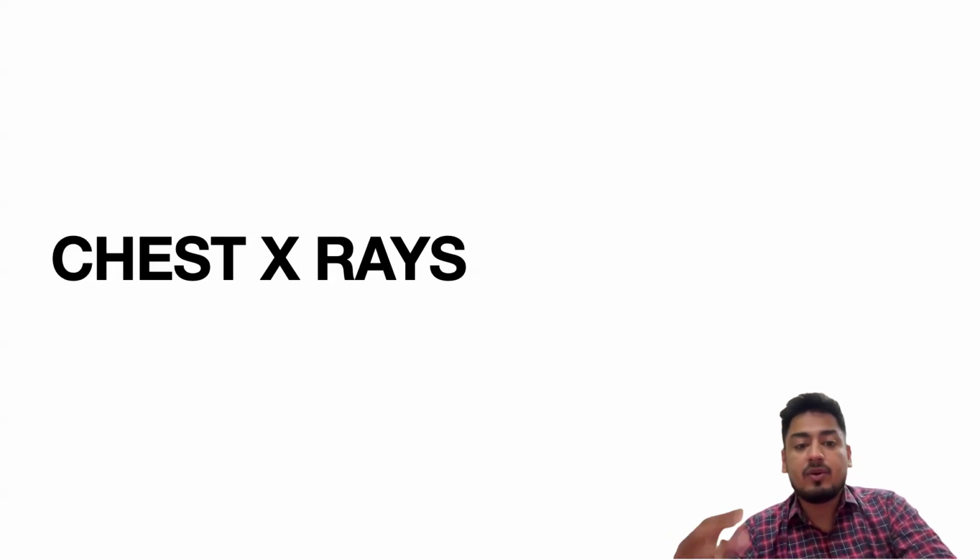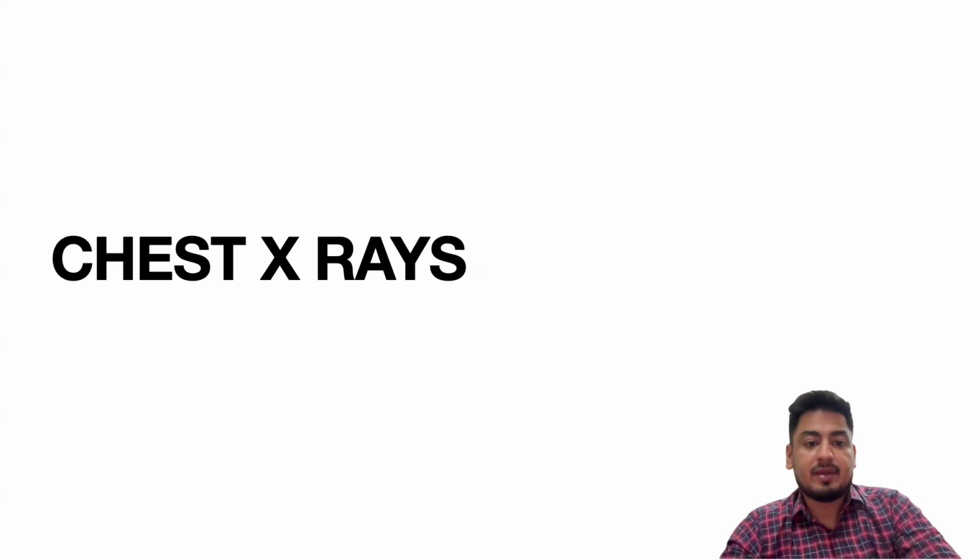So today I'll try to complete the approach to X-ray in such a way that you will be able to correct the questions that will be asked in NEET PG and INICET, as well as clear the viva of your final year MBBS as well as your MD level exam.